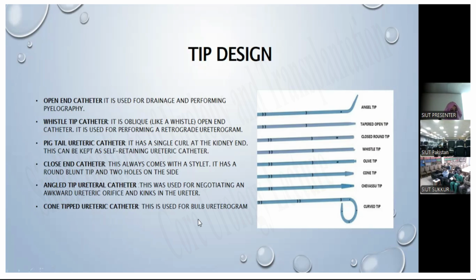So these catheters have got their tips, and these tips are for a purpose. So they are not without any purpose. Again, it depends upon you how you use them, whether you know your instrument, you know your devices or not. So nobody would tell you that you have to do it this way. You have to think this yourself. This is where your own free thinking starts as a surgeon. So urology and any surgical field has got a point when you do your post-graduation, perhaps, when you start thinking to the best use of instrument so that you can gain something for the patient.